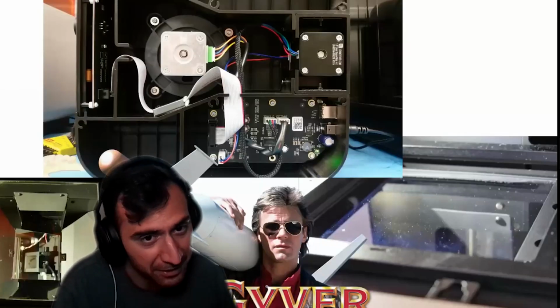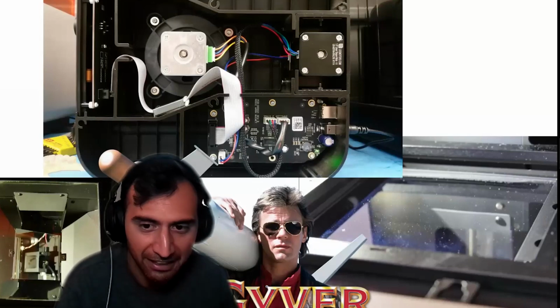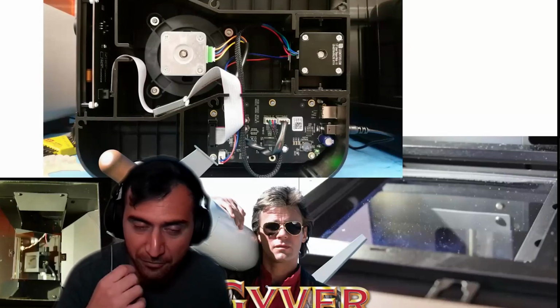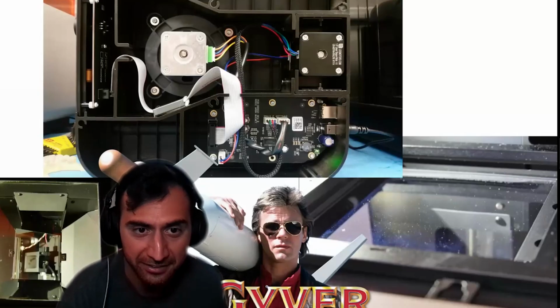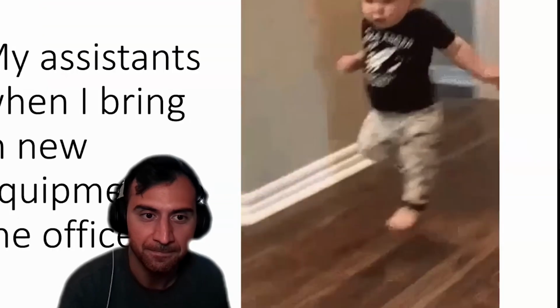And of course, depending on the company that you work with, sometimes they require you to open these things up and actually become MacGyver and fix them. I tend to, like I said, we've bought our SprintRay through Patterson, and they actually will come and troubleshoot it before they have to communicate with SprintRay. They say, hey, we need a new printer hot swapped while we take care of this printer.